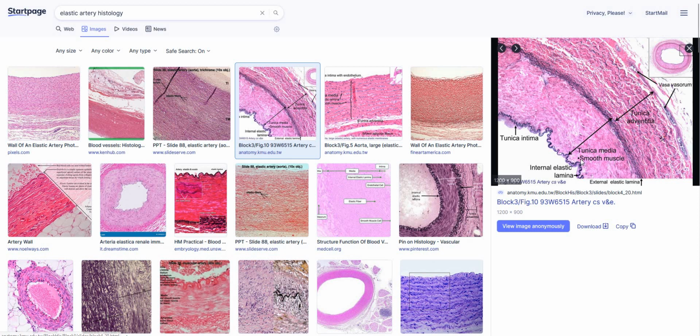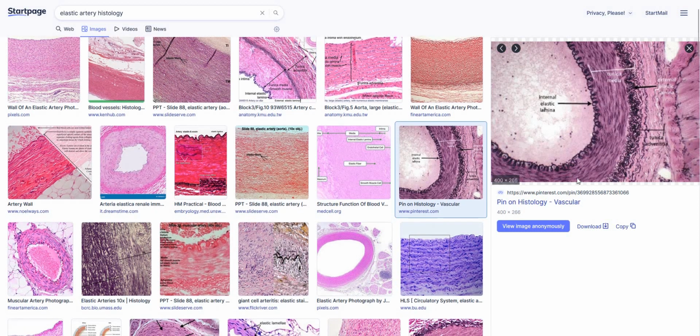So here we can see a really dark squiggly boundary of the artery. This is specifically an elastic artery. So this is elastic tissue. If I indicated this on a slide, the answer would be elastic connective tissue. So pretty straightforward. It just takes practice working with examples. This is another great example. So we've got that darker stained elastic tissue.